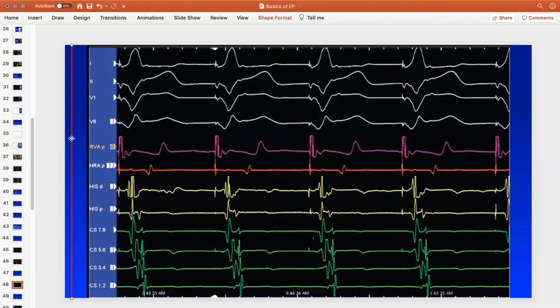Okay, so let's take this. Ahmed, I'm just presenting very simple stuff. Like what Nasser did, orient yourself and let's start. Okay, so what do you have? We have a surface lead, and lead 1-2 will be V1 or V6. The surface lead shows a spike of pacing, obvious. It's pacing all over. All the beats are paced in the surface.